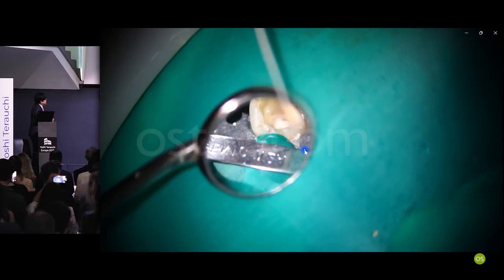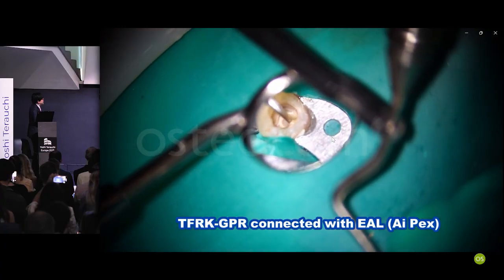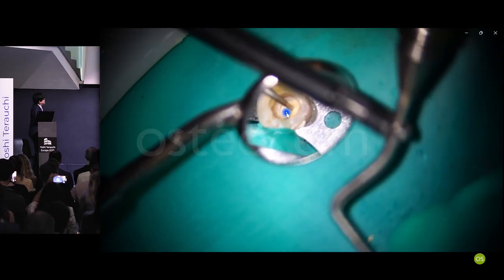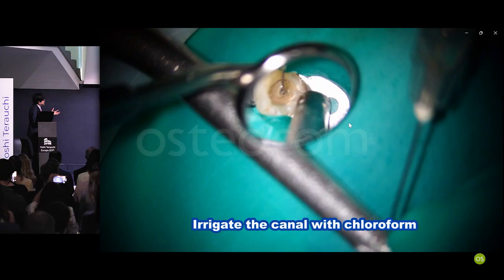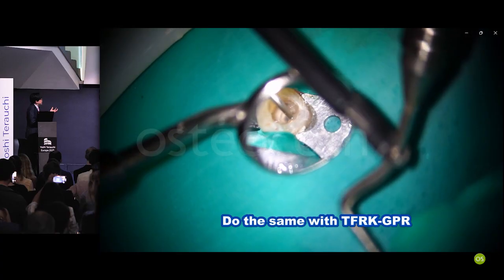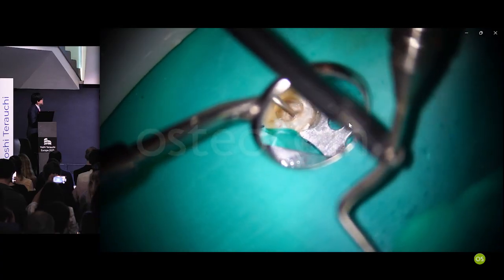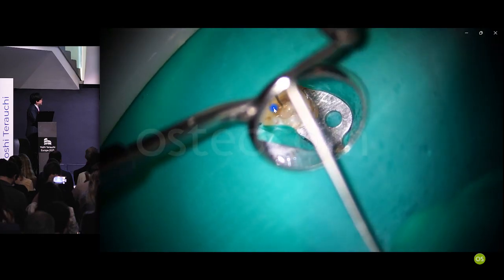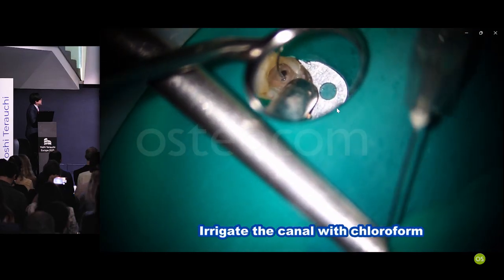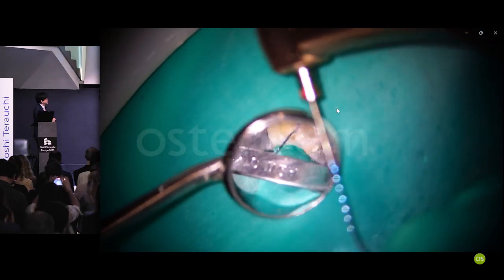So you can irrigate the canal with chloroform. You can agitate it with a hand instrument. This is GPR. I'm agitating chloroform. So it turns white again. Then irrigate the canal with chloroform and do the same. If it stays transparent, then there's no more gutta percha remaining inside the canal. So as I'm agitating chloroform, there's no change. So I think I removed all the gutta percha fillings.